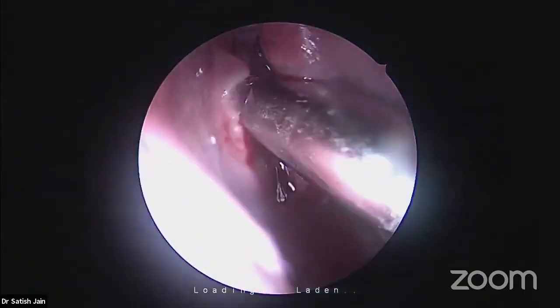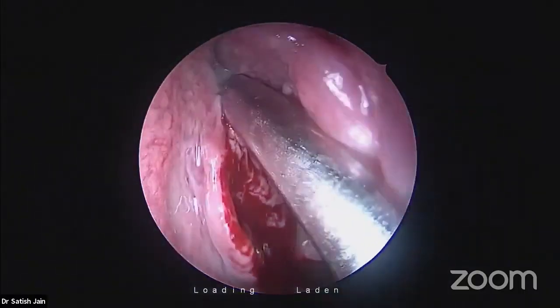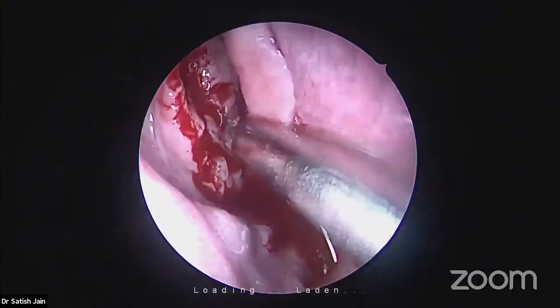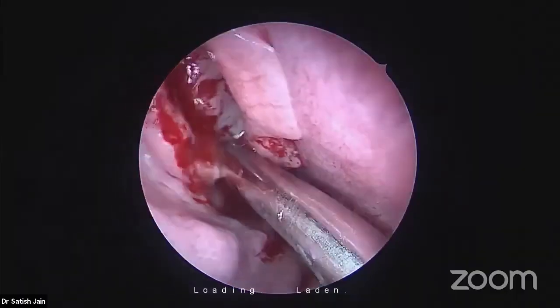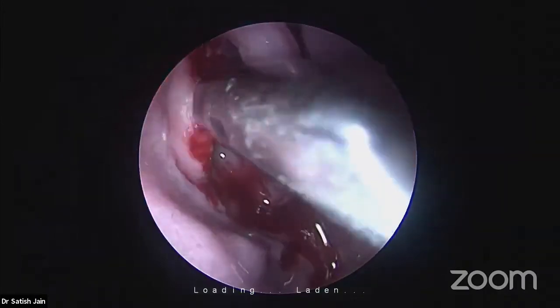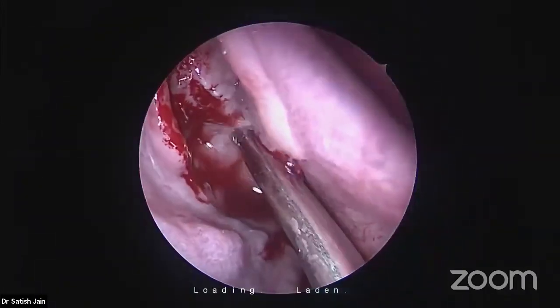I said, by giving local injections, you create the mucosa to be unhealthy. You have some bleeding points with the needle points. See all these polyps I am removing, and you will be able to see the anatomy better now.